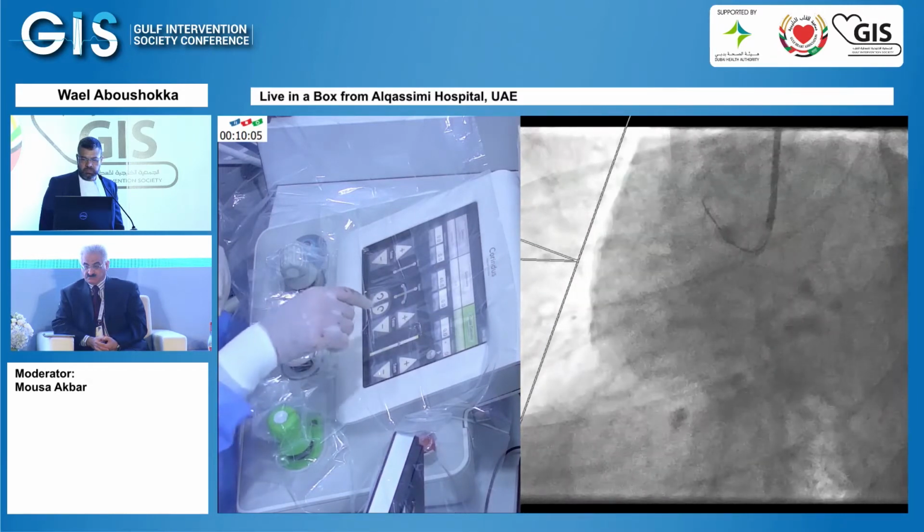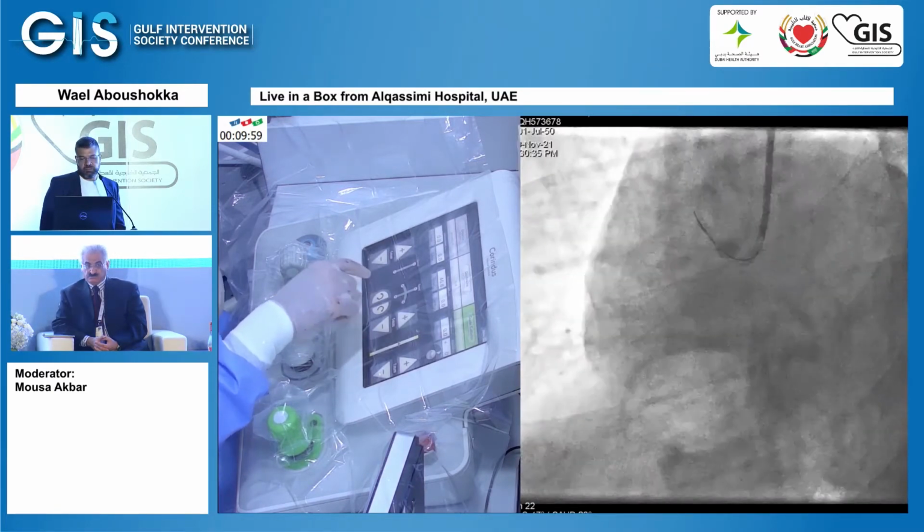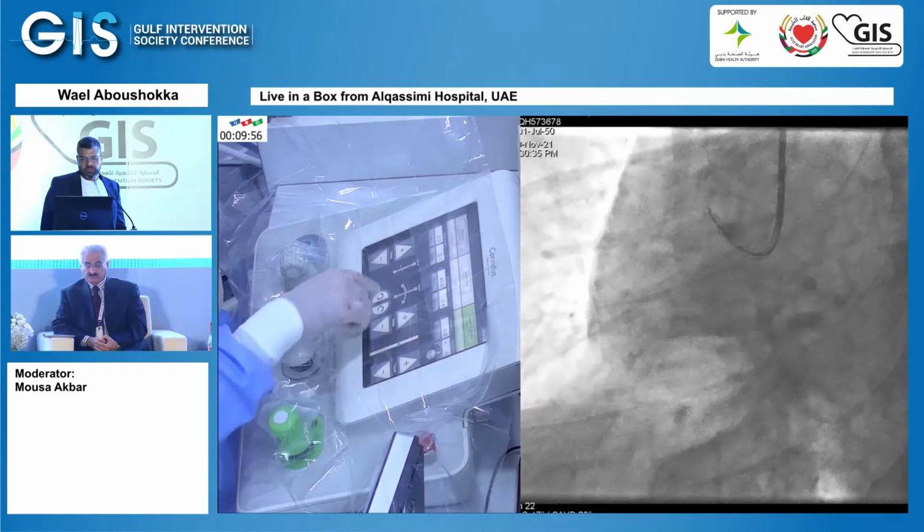We can use the 180 degrees turn from the console for the wire.